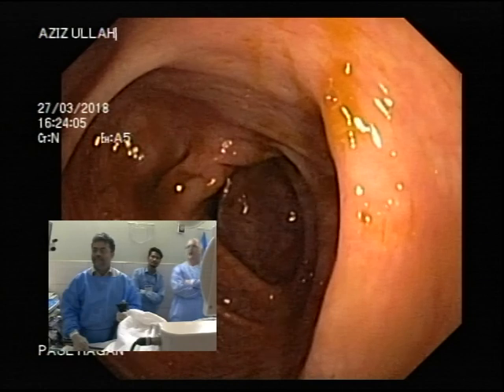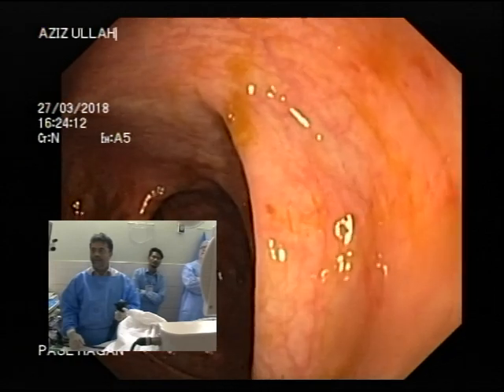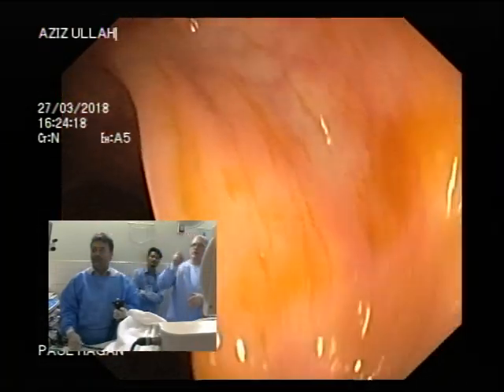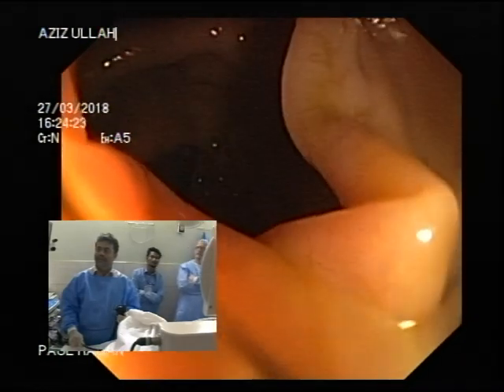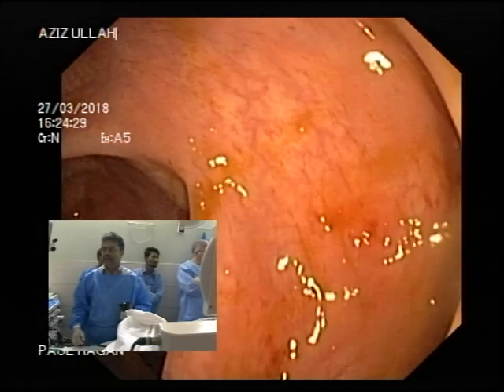That's fine. It's just that I thought we saw a little bit of heme, but we didn't. Come back. Yeah, there. So that's where you've been sucking. Can you see the little suction artifacts? That's when you've got the mucosa and you've sucked on it, and you've given her a great big love bite. Yeah. No more pictures.